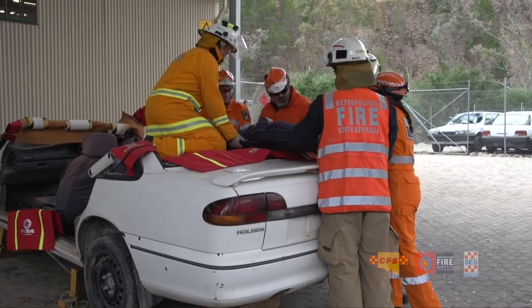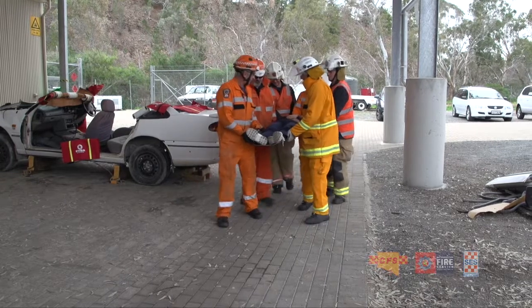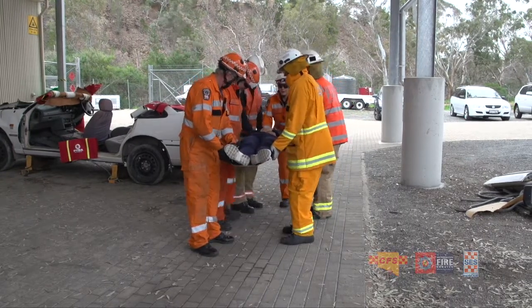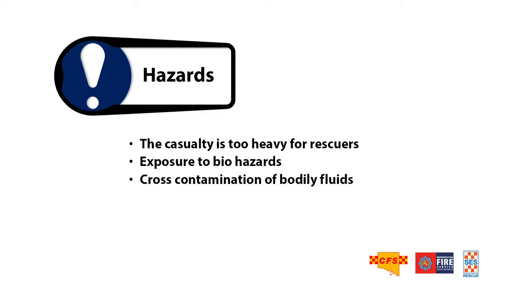The crew member at the head of the casualty must clearly advise the team of people lifting the spinal board where the final destination is and how far it is away from the vehicle. Hazards to be aware of are: the casualty is too heavy for rescuers, exposure to biohazards, cross-contamination of bodily fluids, exposure to sharp edges, vehicle instability.